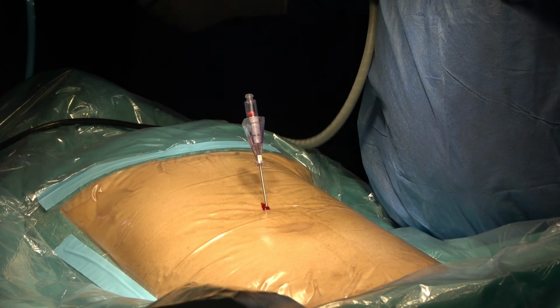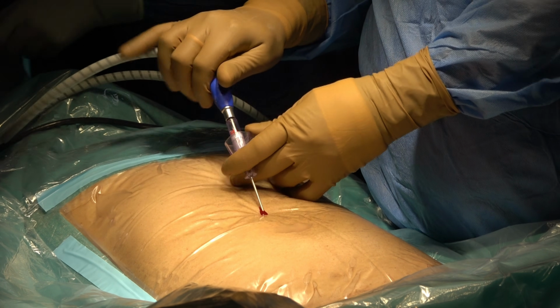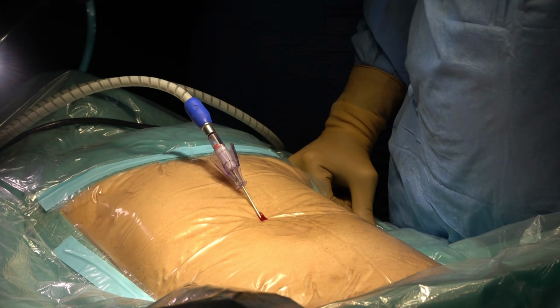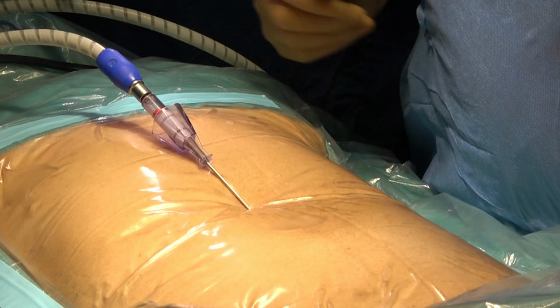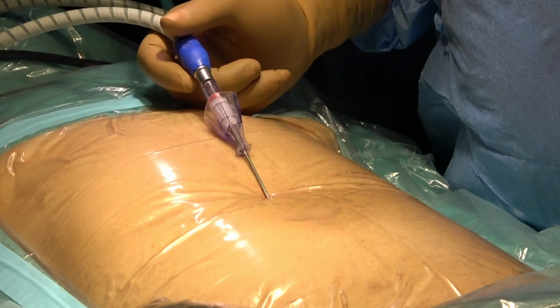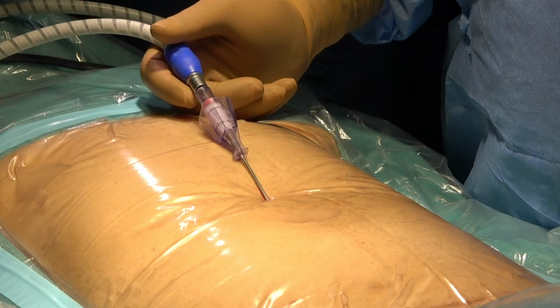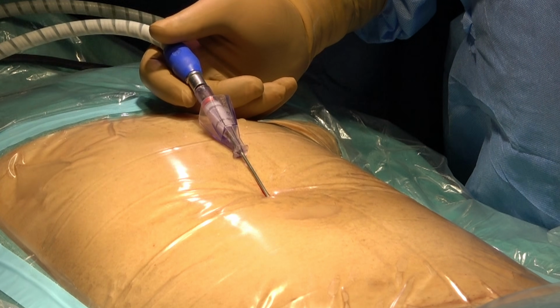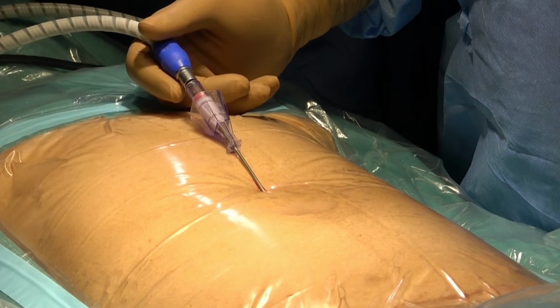So here the plan is that first you will do diagnostic laparoscopy to rule out everything is fine, and after that we will do hysteroscopic resection of the myoma, and after that we will do the tubal patency test also with the ICG. So this is very important: if you are doing any operative hysteroscopy, and together you do diagnostic laparoscopy, you have a lot of advantage.